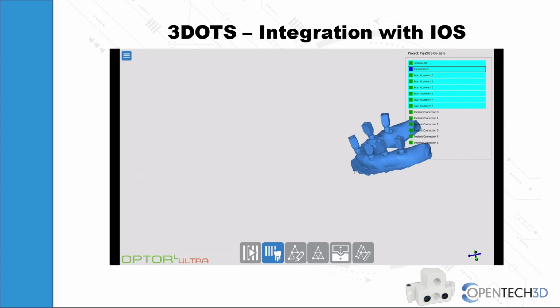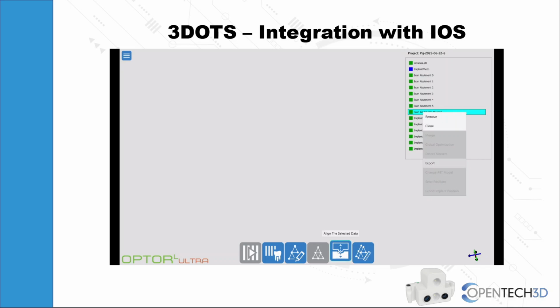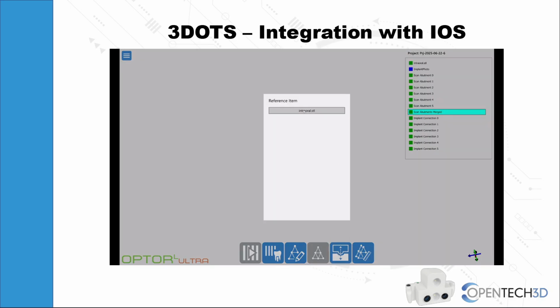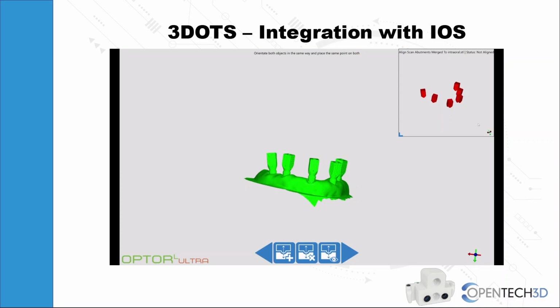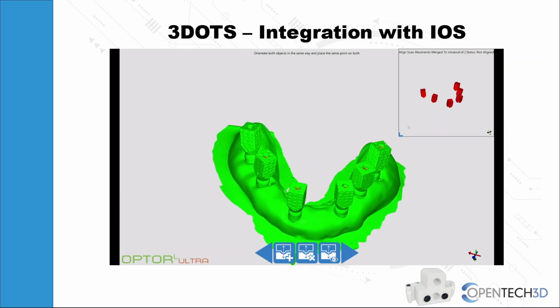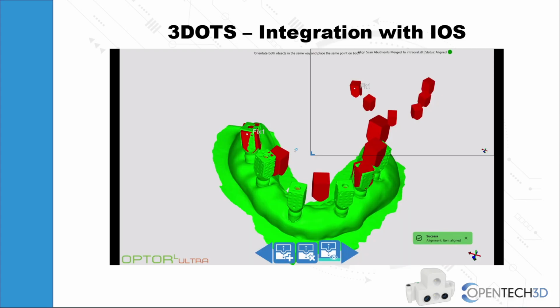Of course, this data coming from a tool that is not photogrammetry is not aligned with the photogrammetry data. We can see it well. The scan of the tissue is in one point in space, while the photogrammetric scan is somewhere else entirely. This software allows us to realign this data with each other. Here we are moving all together, not individually, because we want to keep the relative positions unchanged.